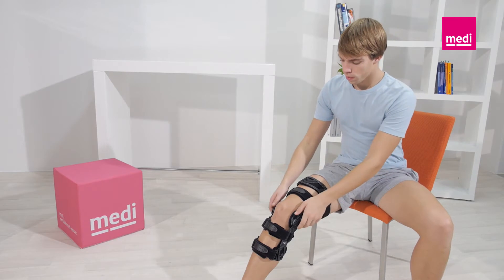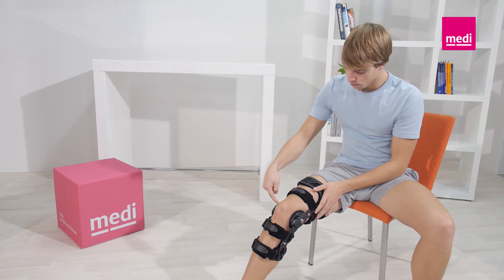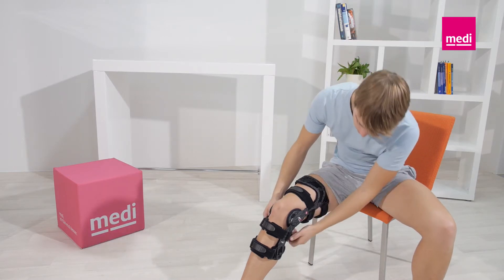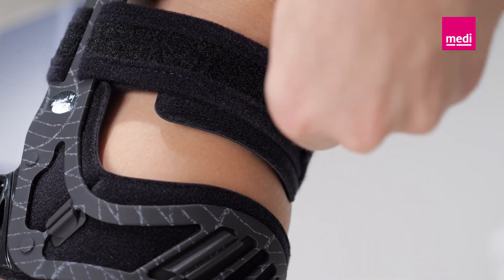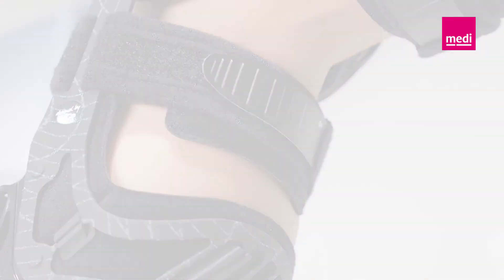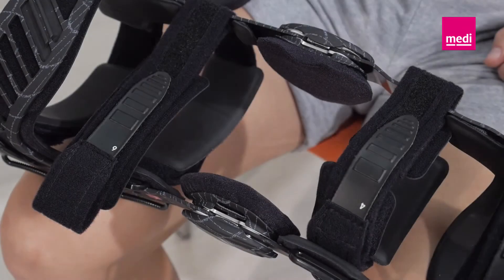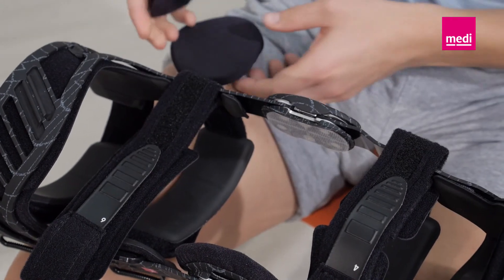If the orthosis does slip, please check that the orthosis hinge is correctly positioned at the level of the superior border of the kneecap. Check the position of the calf strap number five — this should cross above the widest part of the calf muscle. Add padding to the inner surfaces of the knee hinges using the extra padding supplied with the orthosis.